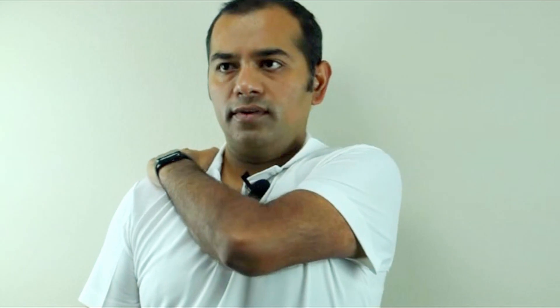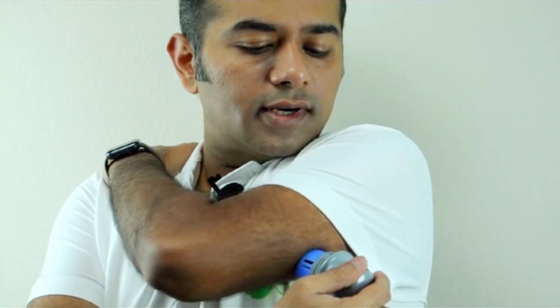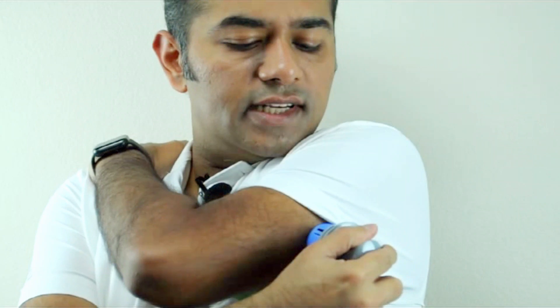Now that the surface is clean, remember we put this sensor on — take it out. Put your left hand on your shoulder, reach around where your sleeve ends, and press. That's it, it is that simple. As you can see, the sensor is firmly placed on your arm.